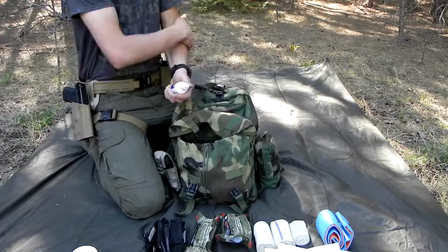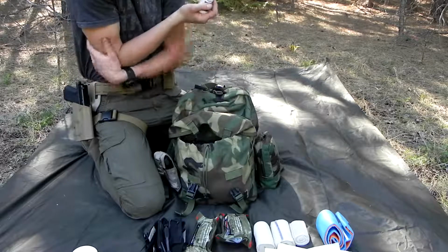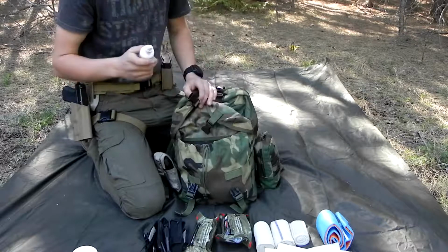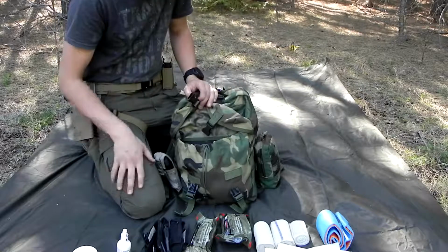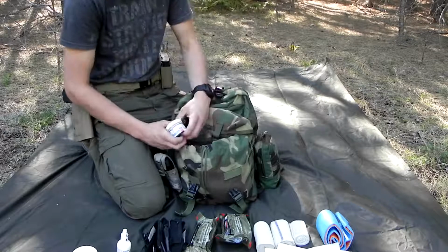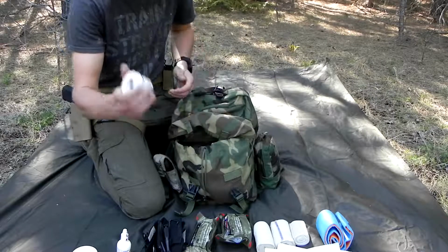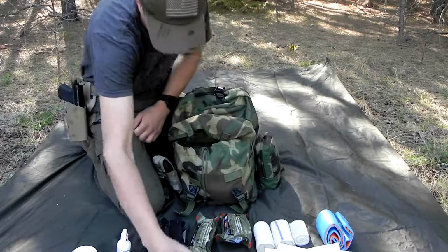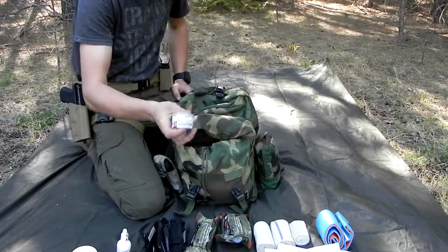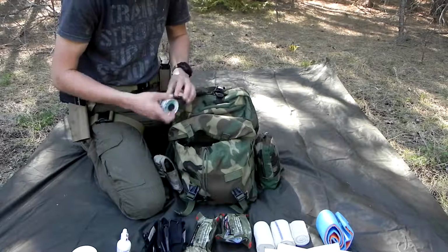And then I have nasal spray, because if you're coughing in the field, especially when you need to be quiet, the enemy can hear you. So doing stuff like this, and that helps keep morale up as well. And then I have some more tape here, just some medical tape. Good for just about anything. And this stuff is really nasty stuff. It sticks really good, like it'll stick through blood and water.